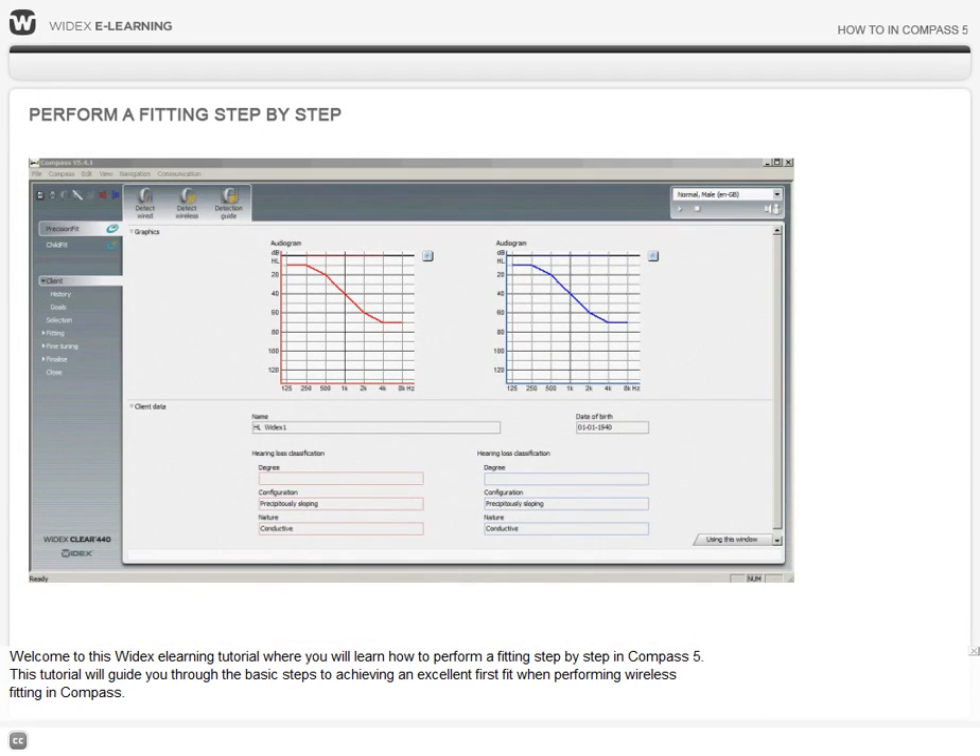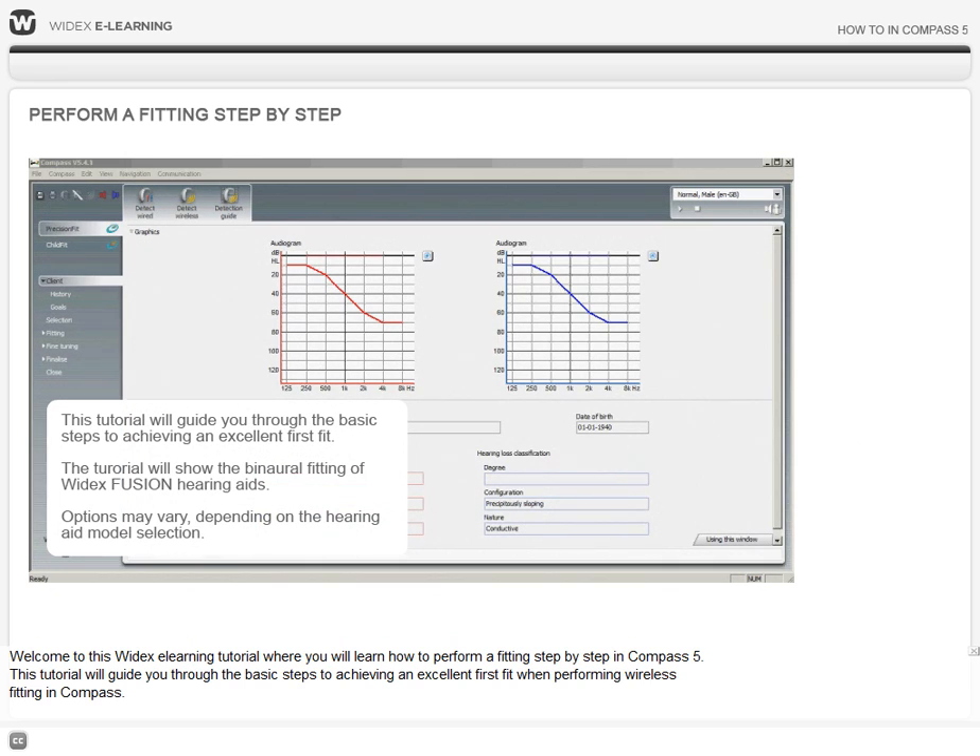Welcome to this Widex eLearning tutorial where you will learn how to perform a fitting step by step in Compass 5. This tutorial will guide you through the basic steps to achieving an excellent first fit when performing wireless fitting in Compass. We have used two Widex Clear 440 Fusion hearing aids with factory preset data in a binaural fitting situation. Options may vary depending on the hearing aid model selection.